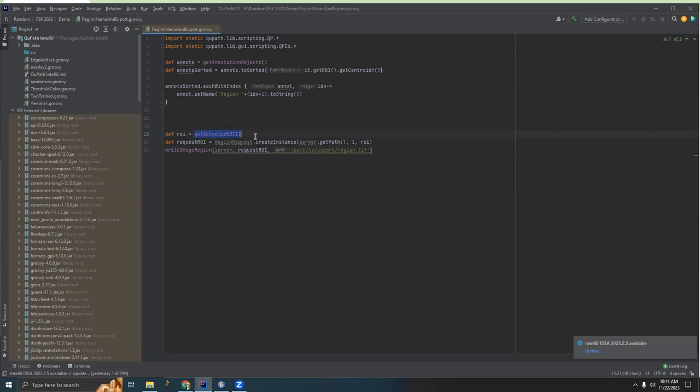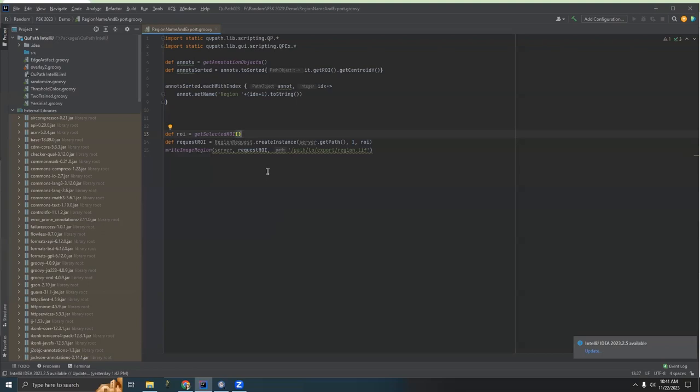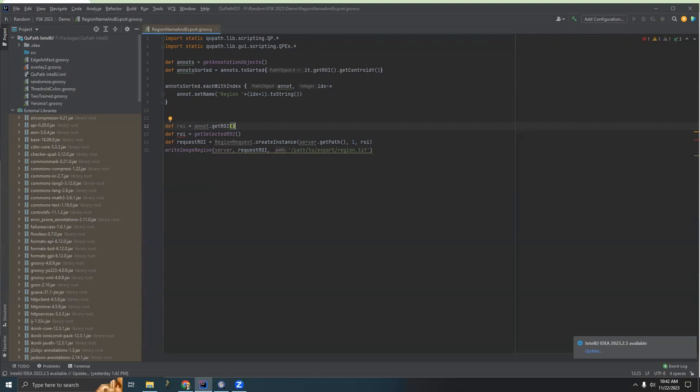So first, the first line it has is get selected ROI. In this case, this particular bit of code is assuming you've clicked on one region and you're just interested in exporting that. But that's not going to work for us. We want to export all the regions one by one. So I'm going to redefine this ROI line, and I want ROI equals each annot dot, sorry, dot get ROI. And we need to do this inside a loop. So we're going to go annotations sorted dot each. Then we can actually just use it here. And let's do that. So now let's delete that.